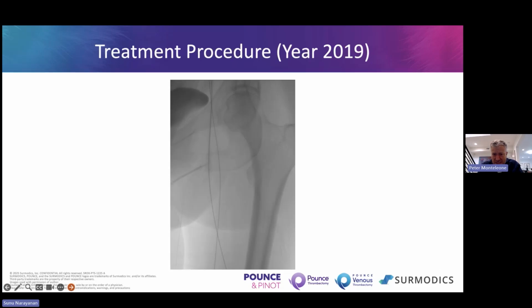I'm reliving my PTSD from this moment. You can see here we have one sheath going above the clot. We have our wire coming down behind the clot, and we're kind of working contralateral, working beyond this sheath through a heavily accessed point. Just kind of a nightmare. You can pull that sheath out, but then all of a sudden this is someone you're giving TPA to who has a fresh arteriotomy in a hole while you're still working. So not a lot of great options.